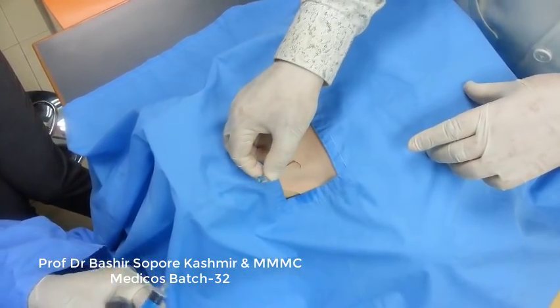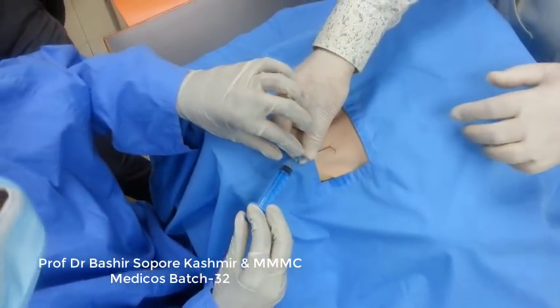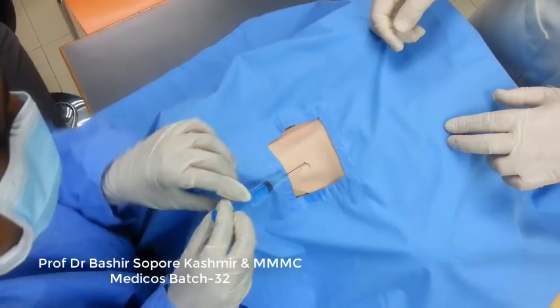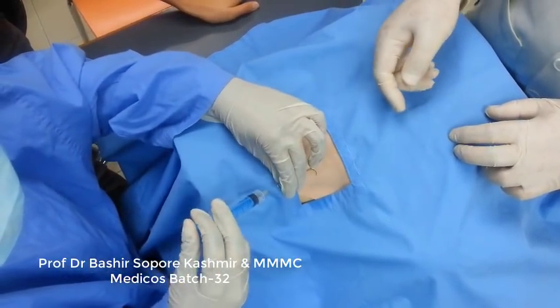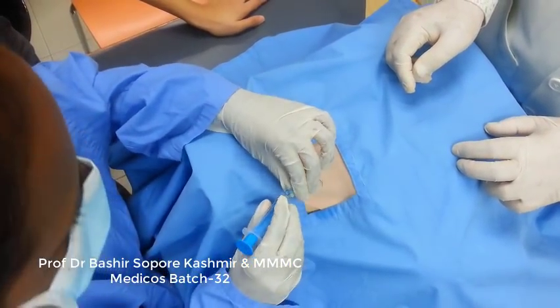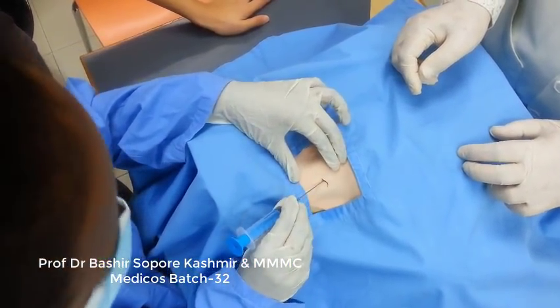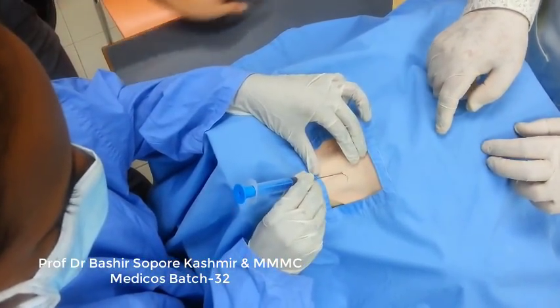You understand my point? Now if we do it again, you see that it is in the vein. Insert it towards the ipsilateral side. You can search again. For explaining, I had to change this, but the ipsilateral side is here.